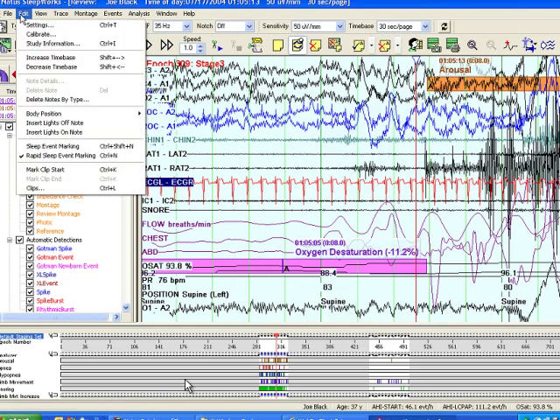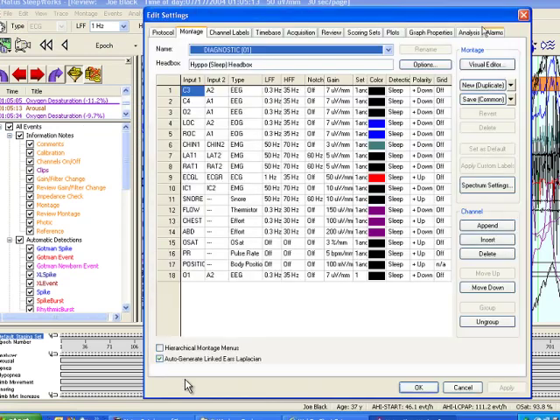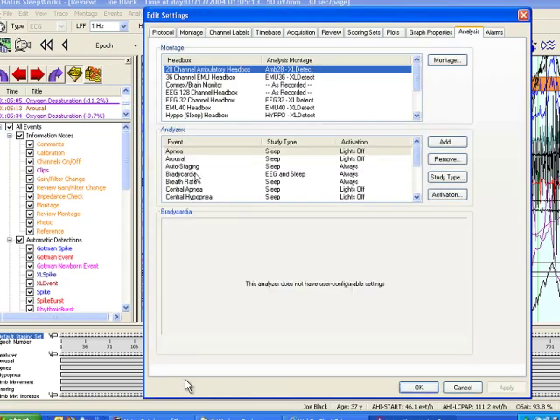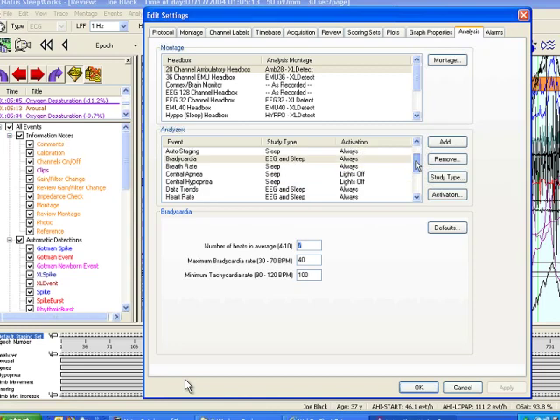Okay? There's another analyzer. Sorry, one more comment about the breath rate and the heart rate. So the heart rate analyzer needs to be turned on. If the heart rate analyzer is on, and you're displaying your digital values, then that will allow the brady and tachycardia analyzers to work also. The brady and tachycardia analyzers are basically based on the heart rate values that are detected. And it's just basically looking at the values and whether you are within the threshold, it'll classify and lay a bradycardia tag or a tachycardia tag.